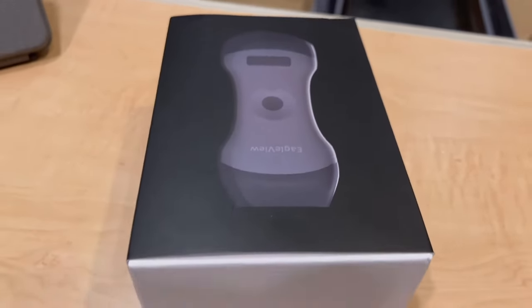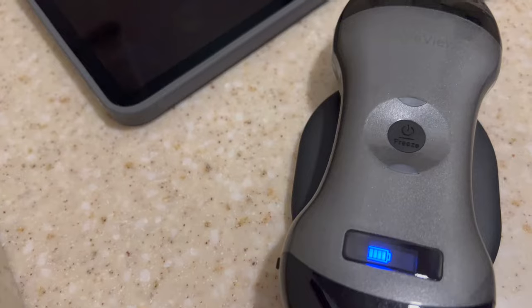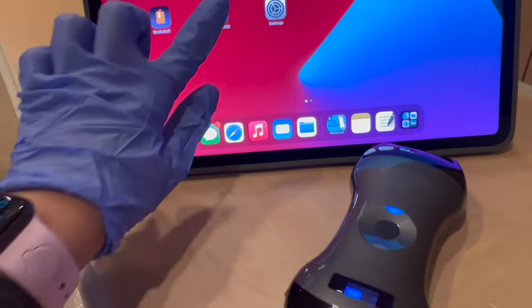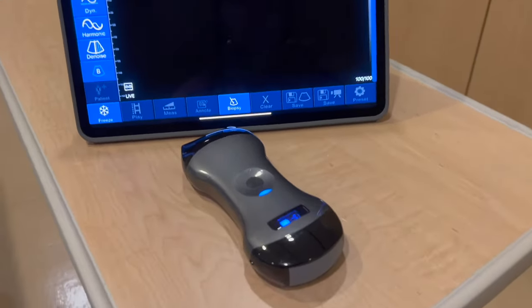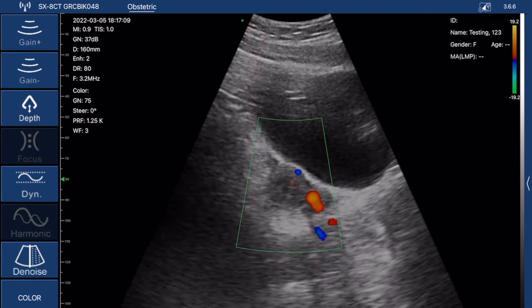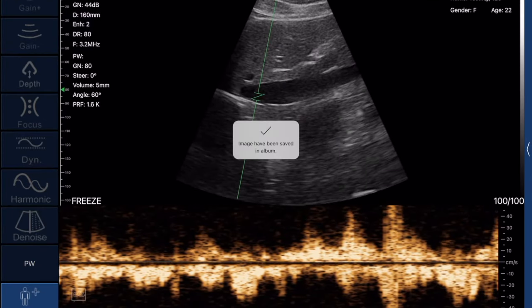Eagle View created a wireless ultrasound probe which makes your practice fully wireless and easy to disinfect. It supports wireless charging, helps reduce the risk of infection, and has a built-in Wi-Fi signal to connect to both iPhones and Android phones. It can do vascular access as well as work as a cardiac ultrasound probe. You can choose B mode, M mode, color Doppler, power Doppler, and pulse wave Doppler, with no extra fees required.